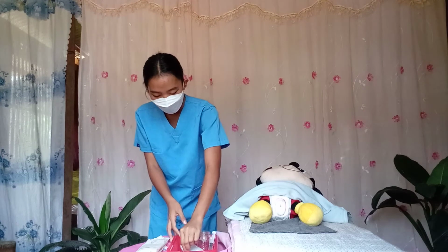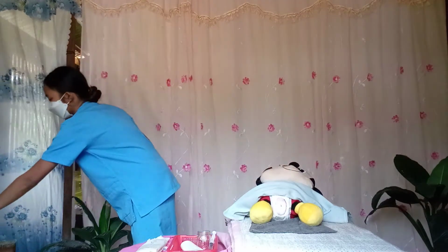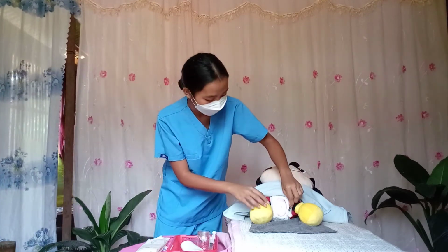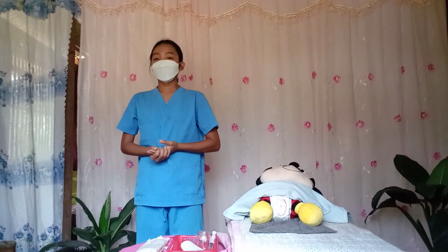Pick another one, do the same thing, and then discard, and another one, then do it on the opposite side. Be responsible in taking good care of the patient and the equipment used in the procedure. This is to maintain the sterility of the surface. The next thing that I am going to do is wash my hands.